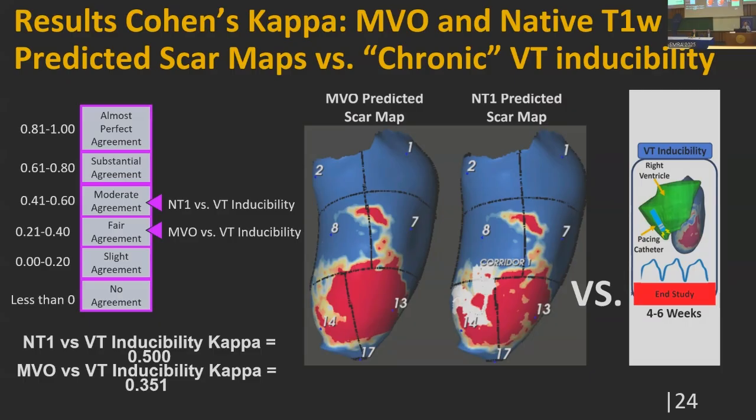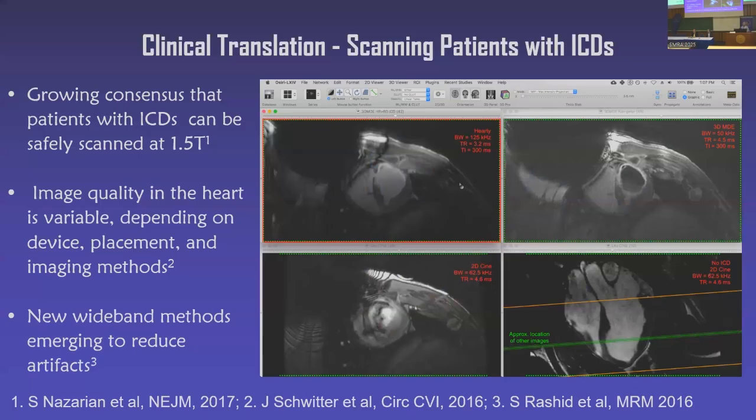Now, it's not perfect yet, and there's lots of reasons for that. There's lots of things we still have to control for in the study, but it's encouraging. We're on the board. So we believe that this is potentially a marker of outcomes in the future, so that presumably you can use that information paraprocedurally to go and fix things while the patient's still on the table. Okay, but again, that's animals, and nobody believes that animals are humans, at least not right now.